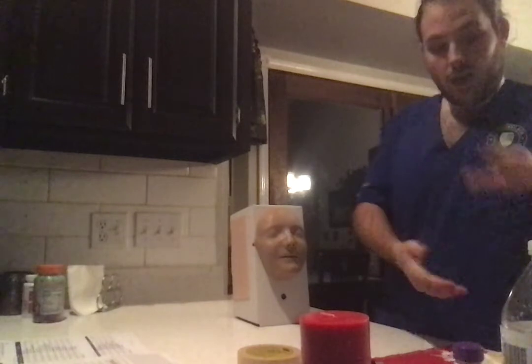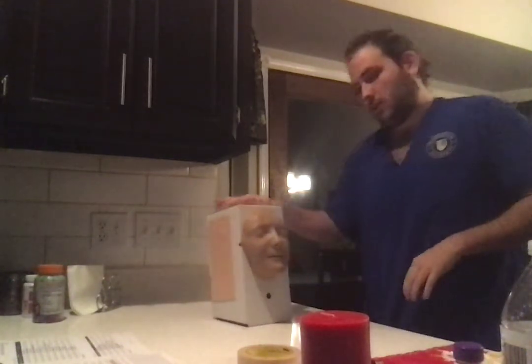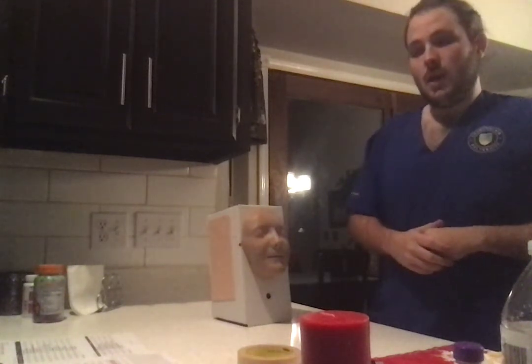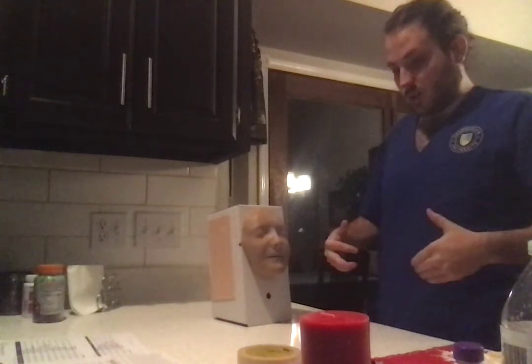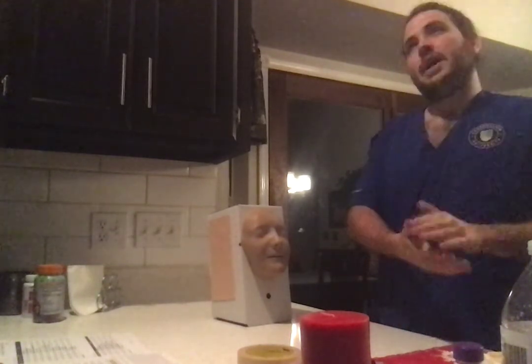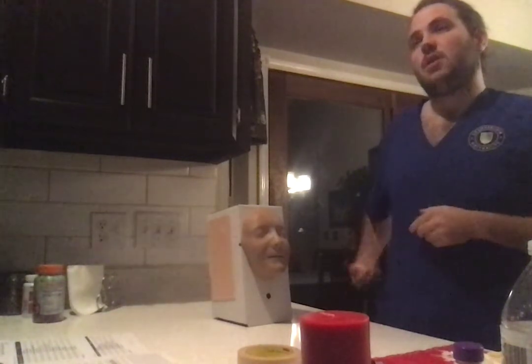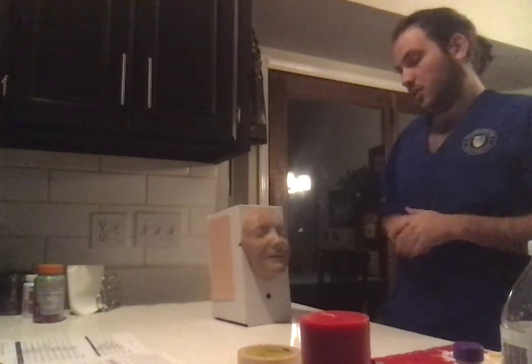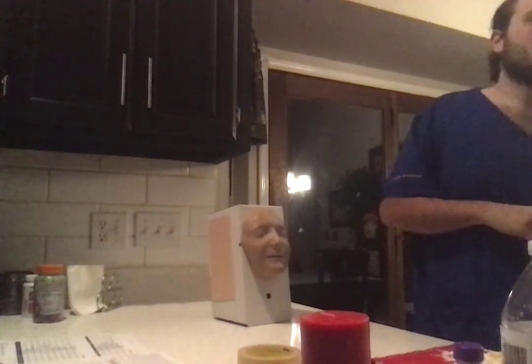We would perform hand hygiene, reassess Mr. Laerdal of his comfort level, his pain level, how he is feeling now that we've removed the tubing. Continue by putting up the side rails, perform hand hygiene again, put the bed in its lowest position, lock the bed in place, give Mr. Laerdal his call light, thank you Mr. Laerdal, and perform hand hygiene as we leave the room. Thank you.